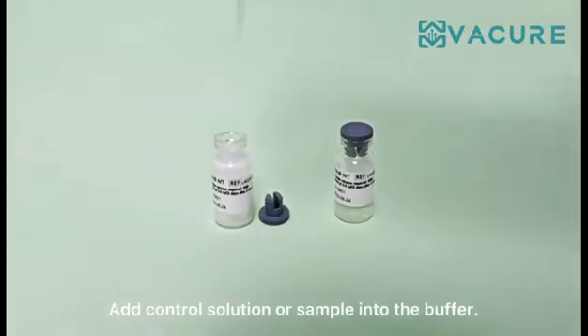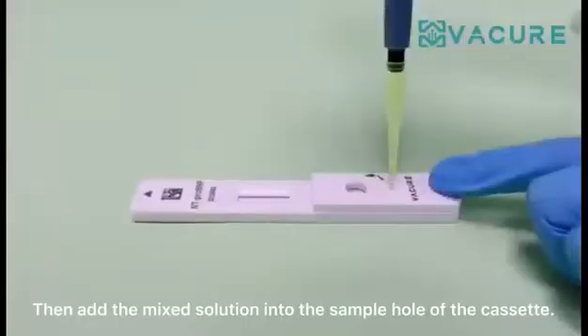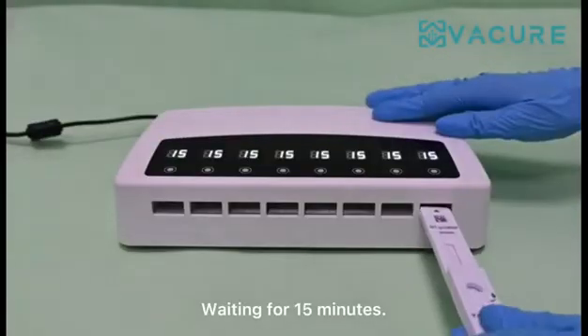Add control solution or sample into the buffer. Then add the mixed solution into the sample hole of the cassette. Wait for 15 minutes.